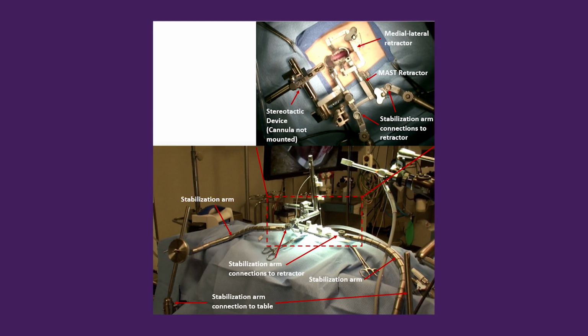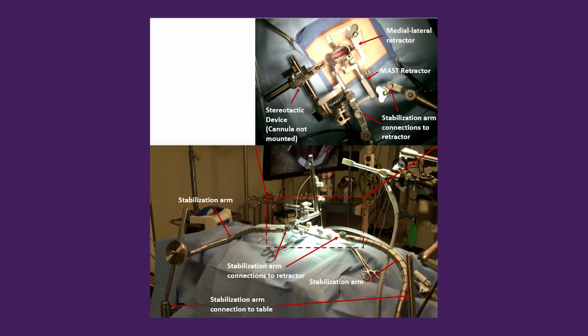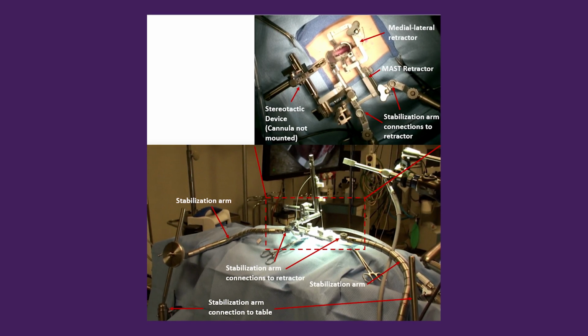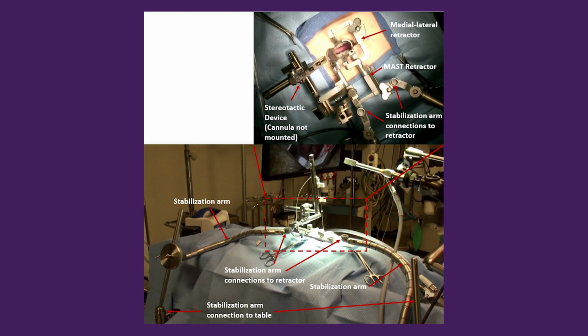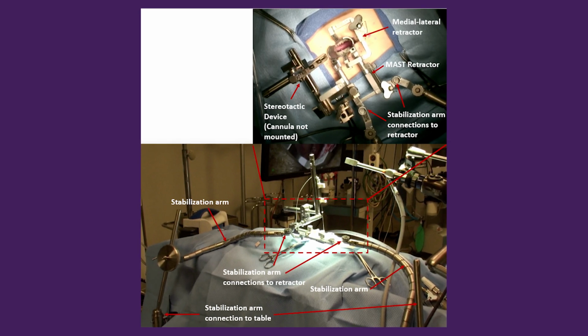Through a series of iterative design prototypes, we also created a design history file. The system itself consisted of two primary components. One of them was a stereotaxic positioning system, which anchored itself on the surrounding tissue of the spine. And the other element of the system was a cannula. And that cannula was intended to take the stem cells and target them to a specific depth within the spine.